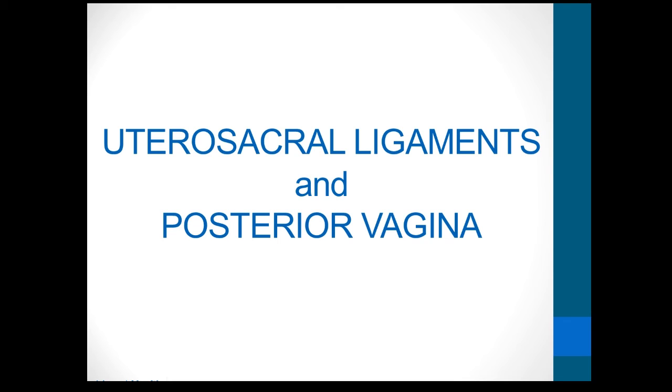We can look at the uterosacral ligaments and the posterior vagina for smaller lesions, just smaller nodules, and I have taken that out of this general presentation because that's probably the hardest thing to look at in isolation, and there is a different presentation just looking at subtle findings in the pouch of Douglas that you can find on the same channel.